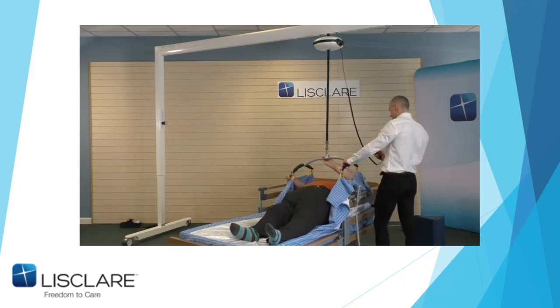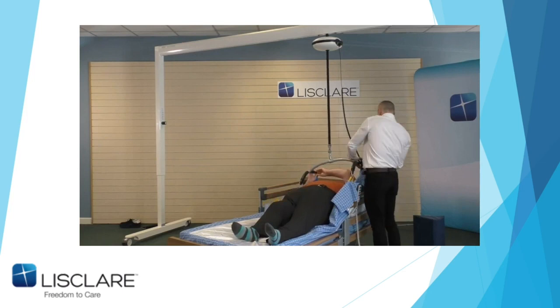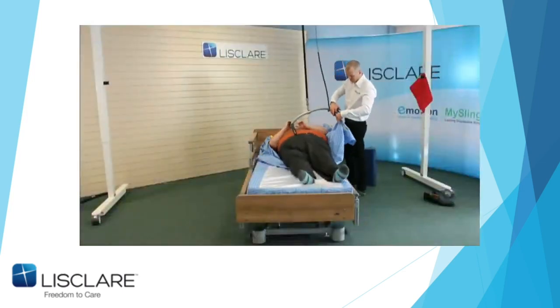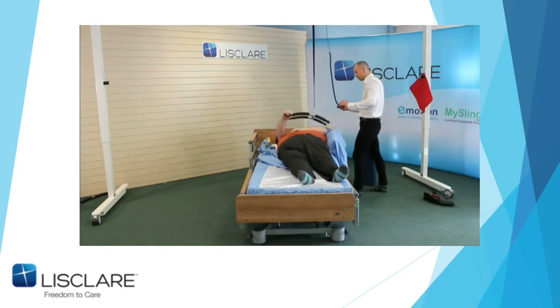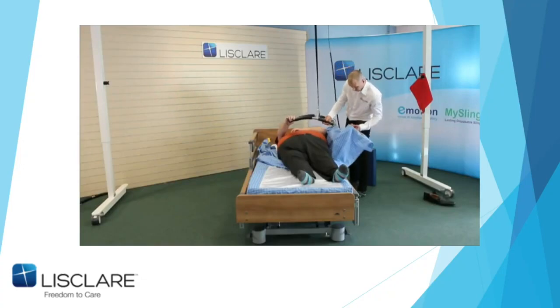And then, John, if I help him out, see him walking round. Now, with this spreader bar, John knows that he has to use that side, okay, because it's going to tilt. It's designed to tilt, you'll see that. So if he hooks the shoulders on, John, head, arms and shoulders. Now, again, you heard my size and weight. I'm going to try and stop this turning me.